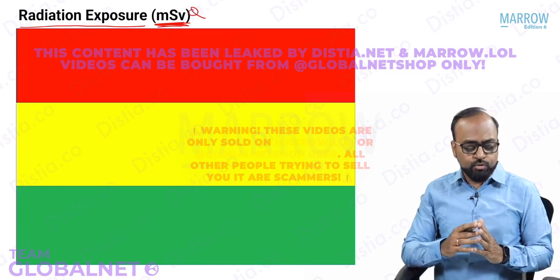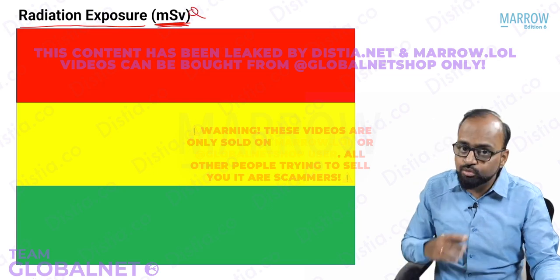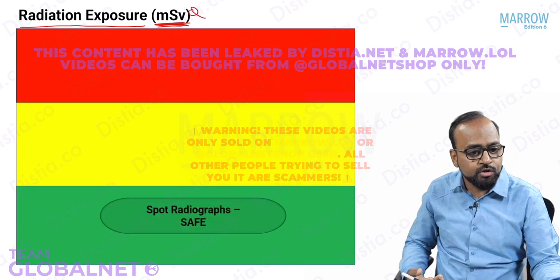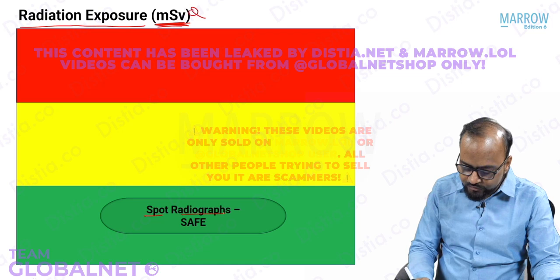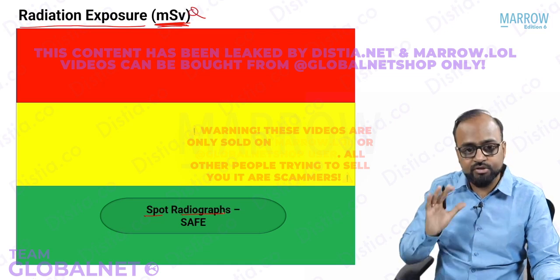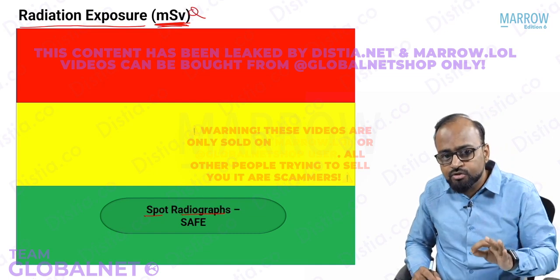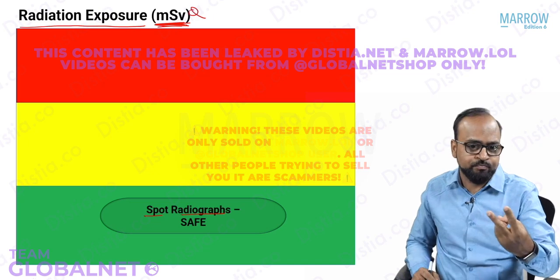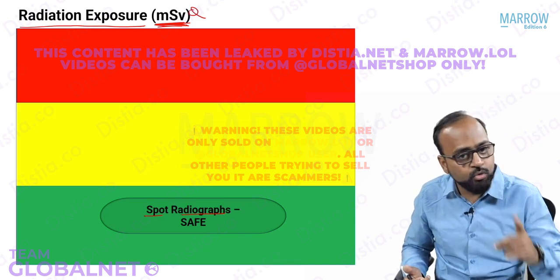Whenever you are looking at radiation exposure in various modalities, just classify those modalities into 3 zones: green zone, yellow zone, red zone. What is the green zone? The green zone is the zone of spot radiographs. These are safe investigations. What are spot radiographs? These are investigations where the patient is exposed to X-rays only once or twice. Chest X-ray PA view: how many times is the patient exposed to X-rays? Only once.